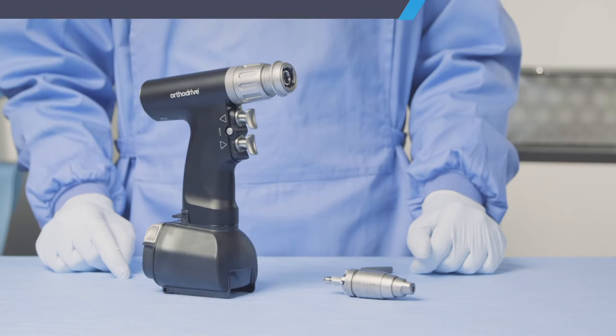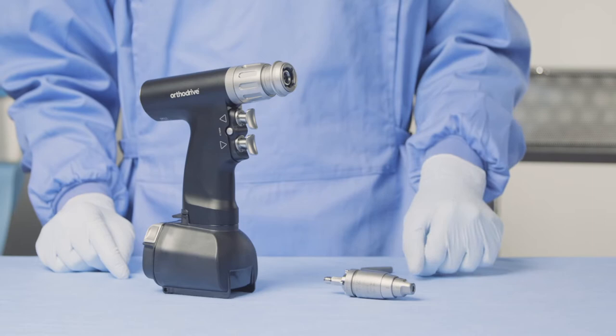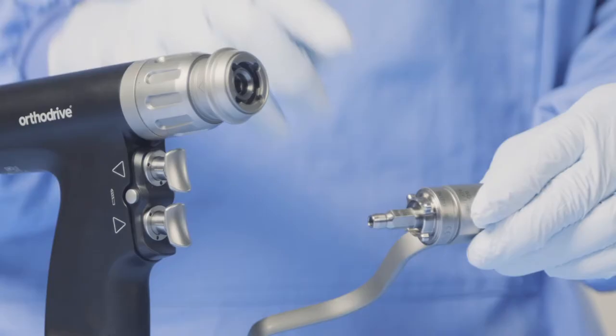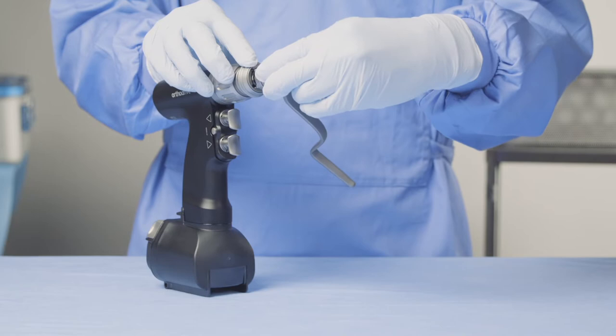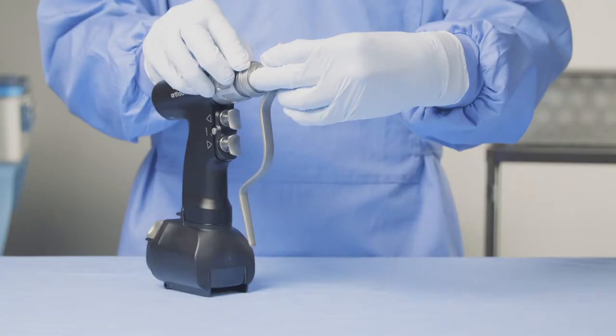The MBQ handpiece has a number of orientation-specific attachments, the most common being the wire driver and the reciprocating saw. Let's take a look at the wire driver and how to insert it. Firstly, take your wire driver and line up the prongs at the attachment site with the notches on the MBQ handpiece by turning it 45 degrees in the anti-clockwise direction before sliding it in. Once it's slid in, you can turn the attachment clockwise to lock into place.